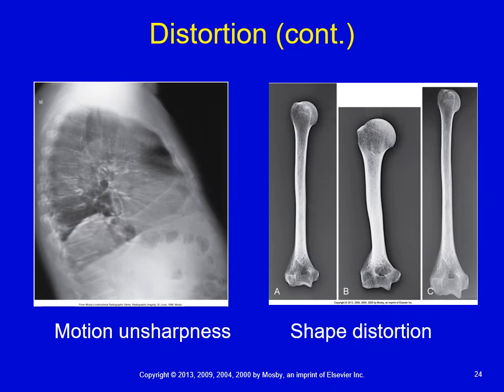All right, so any type of motion, if a patient moves or a part moves, just like in regular imaging, if you were trying to take a picture of maybe your kid or significant other, and they moved, unless you were using the camera setting that's looking for motion, it creates blur in an image. The same thing happens in an X-ray. If there's any motion that's unintended, it's going to give you that unintended blur or motion artifact. Motion, if it is in the image, does detract from the spatial resolution. We're not going to be able to see things as clearly as we need to.